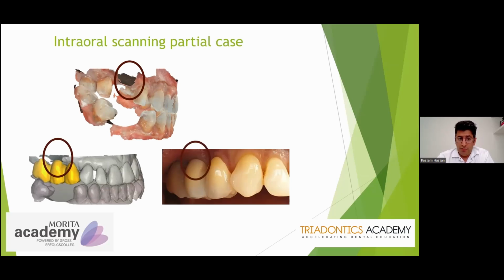We never had issues with scanning teeth for more than 12 years, but we had a lot of issues with scanning gingiva.